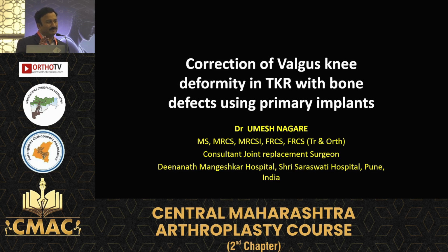So the philosophy of managing the bone defect is not going to change. You have to identify whether it's a peripheral defect or a central defect, whether it's a contained defect or an uncontained defect. So you can manage that accordingly. But your primary goal of a valgus knee correction starts with your soft tissue correction and your bone cuts.